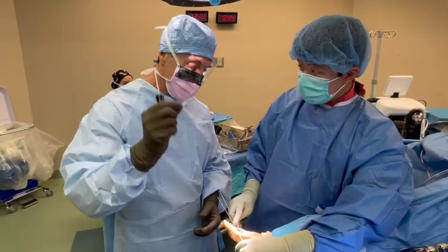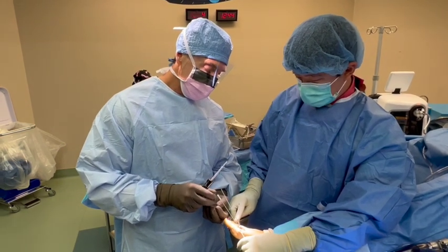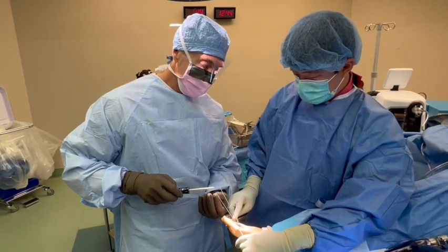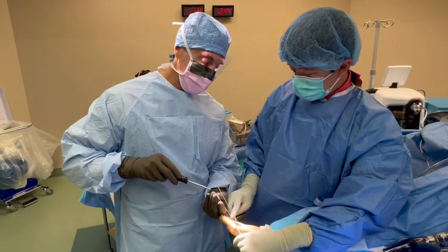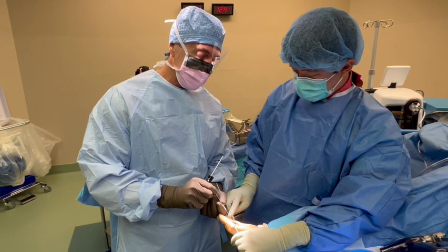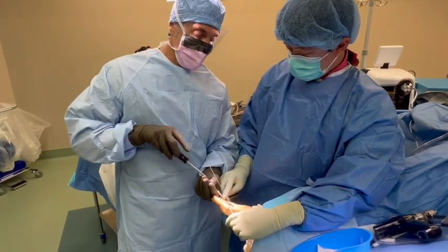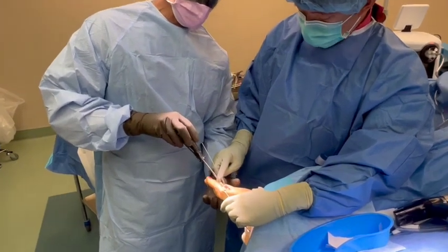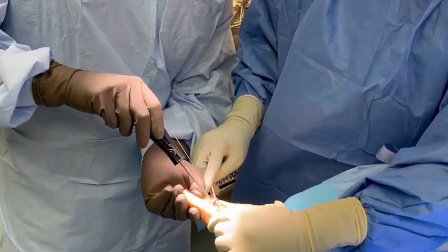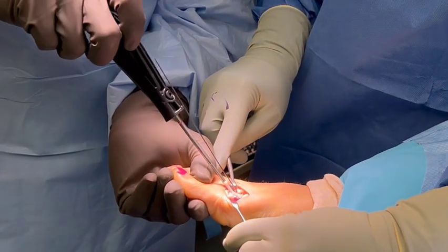It slides right over the wire. And now that it's threaded. The great thing about this product too is I discussed it with the patient beforehand, and she was very interested in having something that was not metallic — a bone product that was actually going to dissolve over time.